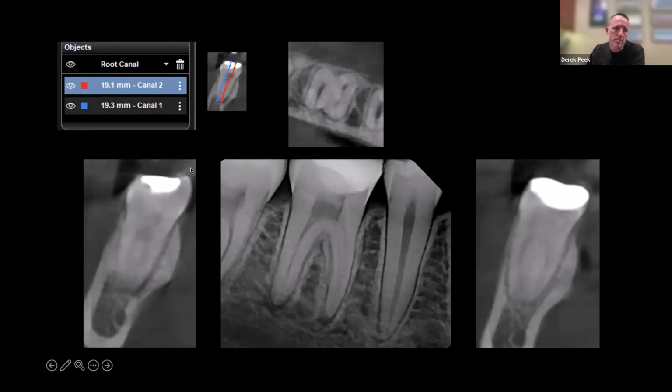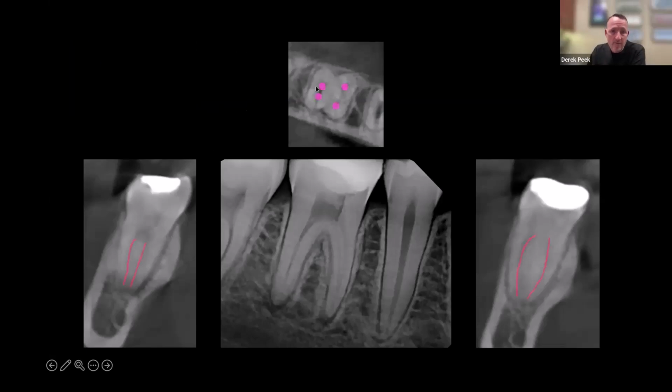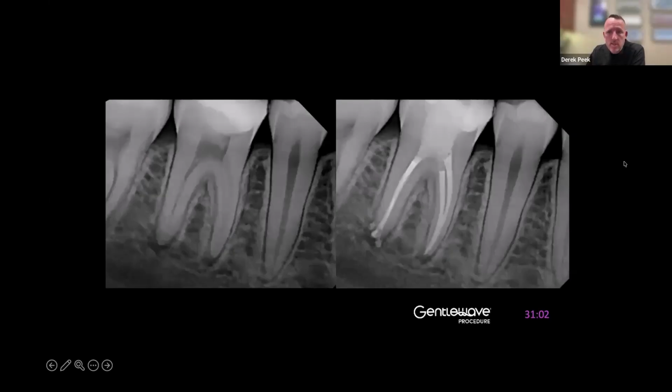In this case, I would just go 19. I want to make sure I can go free and clear to 19. And then if I need to adjust with my actual working length, I can. I visualized. I know I got 2 in the back, 2 in the front. Execute. That's all you got to do. In this one, you get all these deltas in the apex of the distal canal that you maybe didn't know were there. And I think this brings up a good talking point.